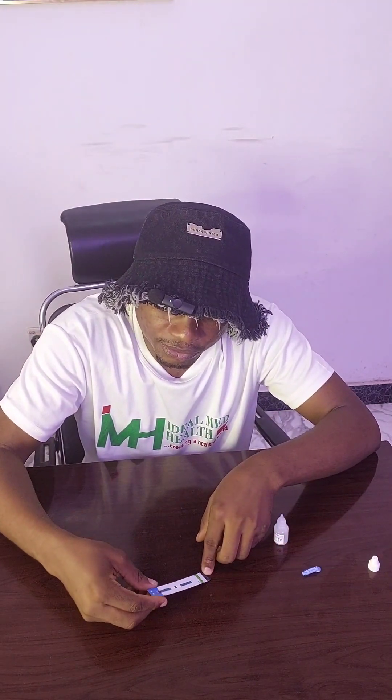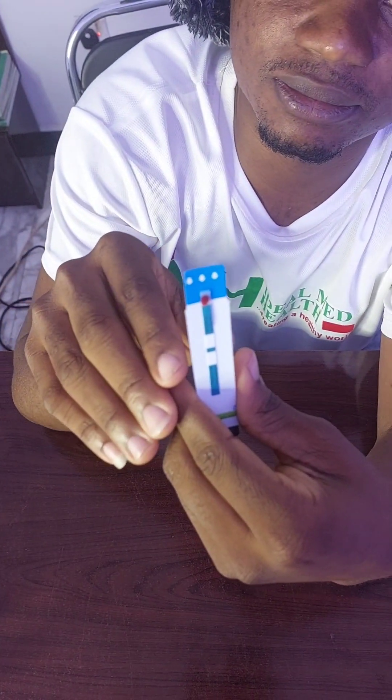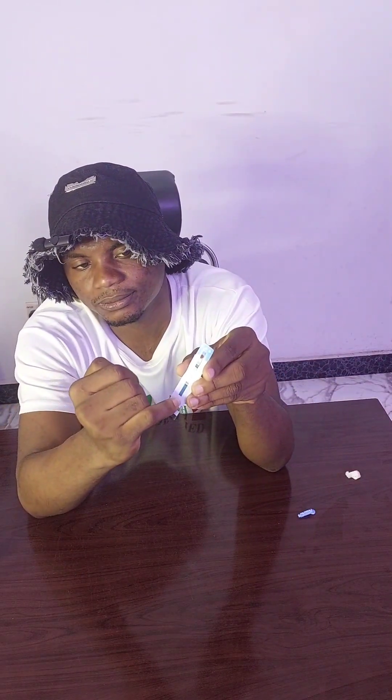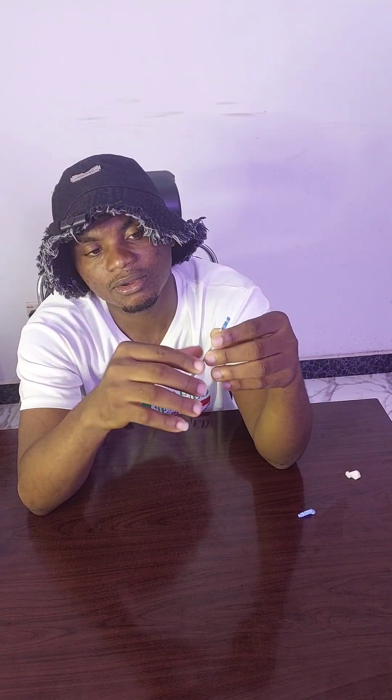The blood is enough. I'll open my buffer solution and add a drop. From here you can see there is an arrow on the strip pointing downward — make sure to orient the strip so the arrow is pointing down. Now let's watch and wait. We are going to wait for 20 minutes before we can take our readings from this test strip.